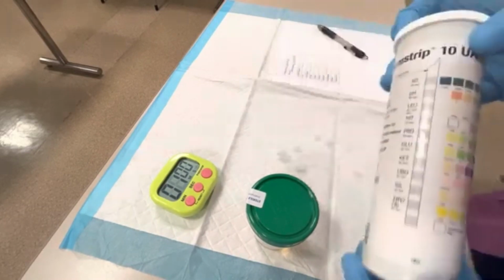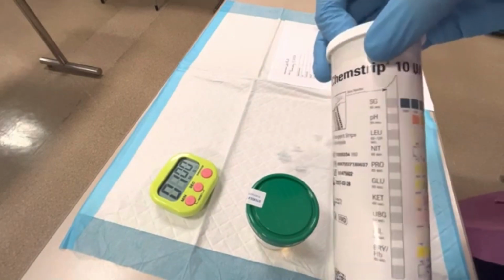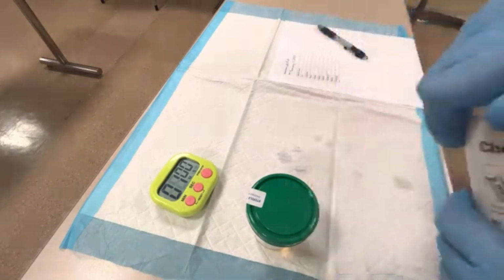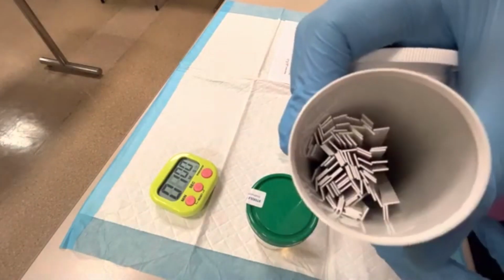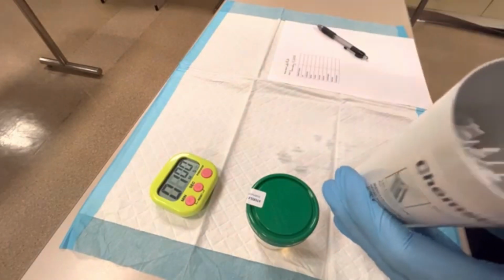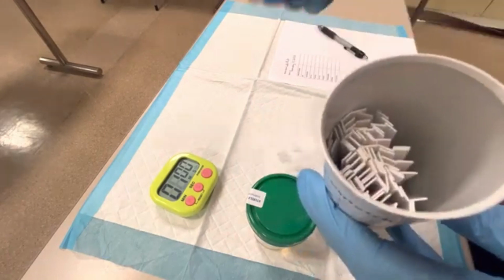So here is my bottle of urine dipstick. Specifically, the brand is ChemStrip 10 UA. This is a Roche product. And if you notice here in this vial, I have a lot of these strips. It's important to note for doing this testing, you only want to pull one strip at a time. You don't want to pull them all out and then pick one.